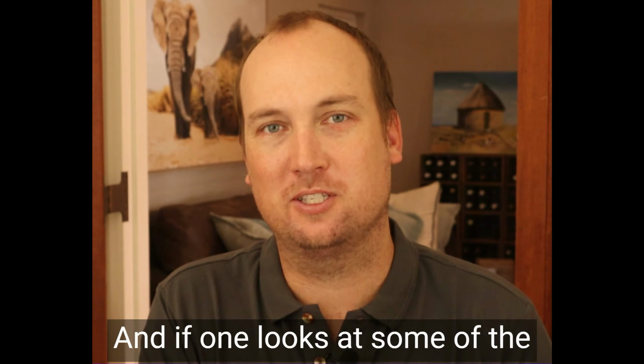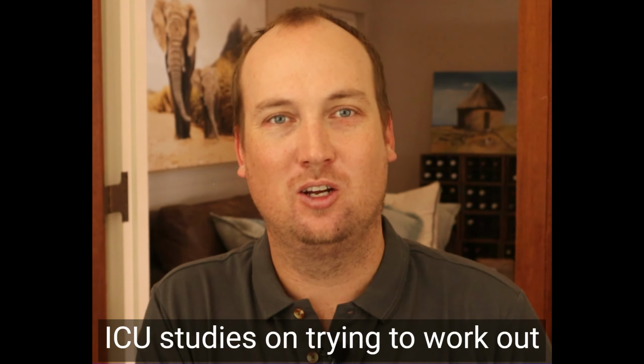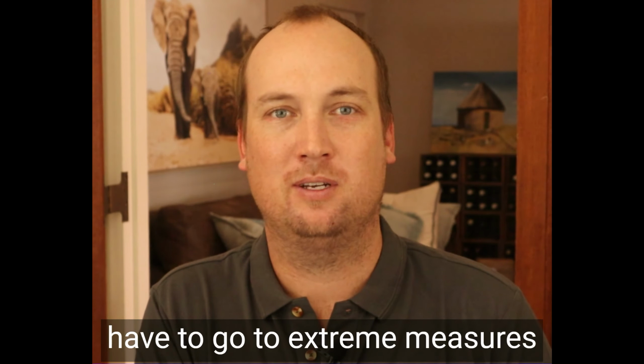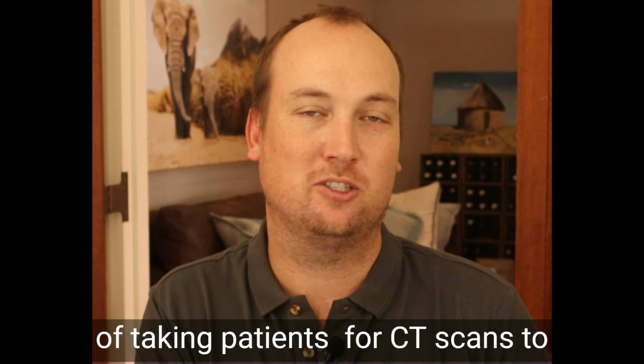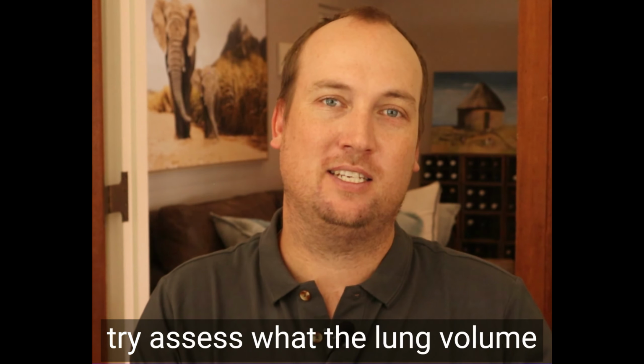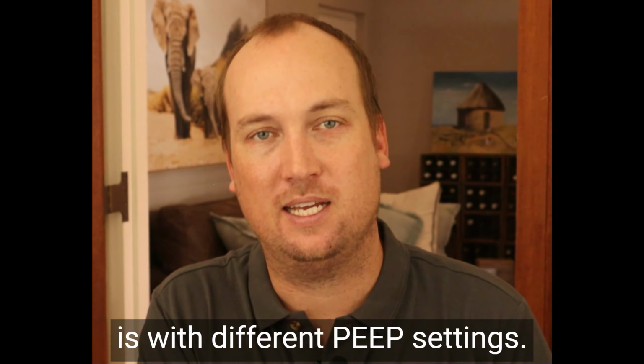And if one looks at some of the ICU studies on trying to work out what the best PEEP level is, they have to go to extreme measures of taking patients for CT scans to try assess what the lung volume is with different PEEP settings.